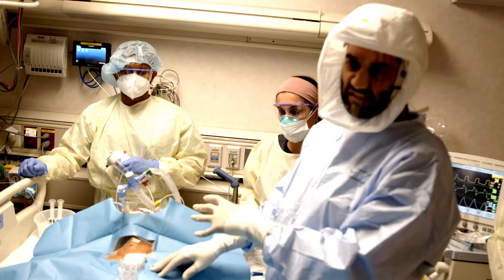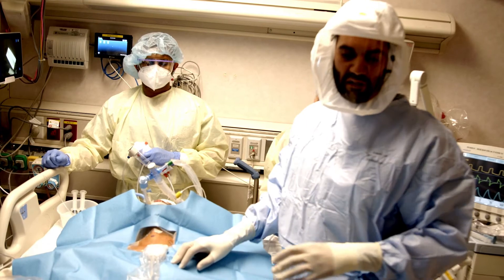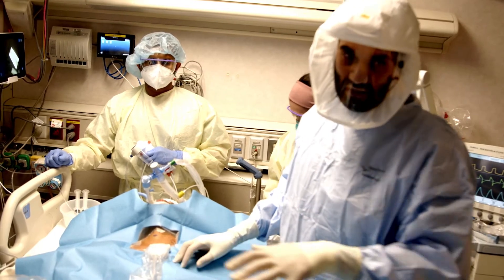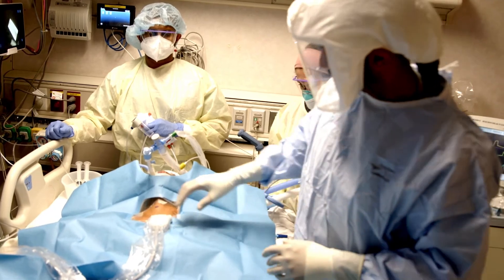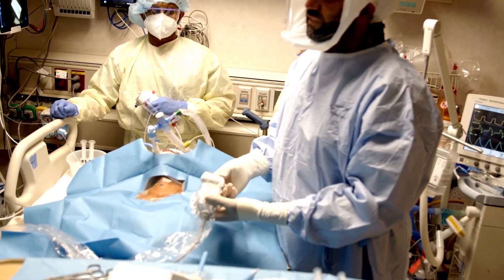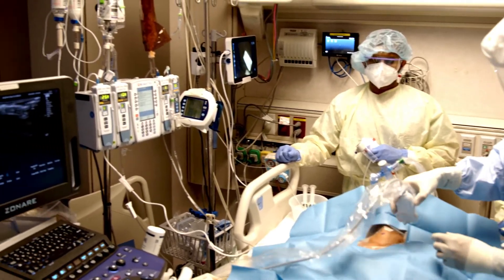First, set up the patient just like you do for a percutaneous tracheostomy — supine, neck extended — and set up all your equipment in the order you're going to use it. The first thing I recommend is taking a look with the ultrasound to examine the anatomy for any blood vessels that could be in the way.